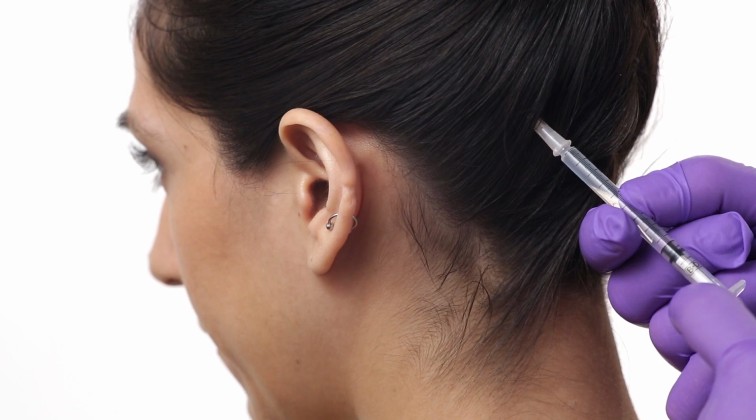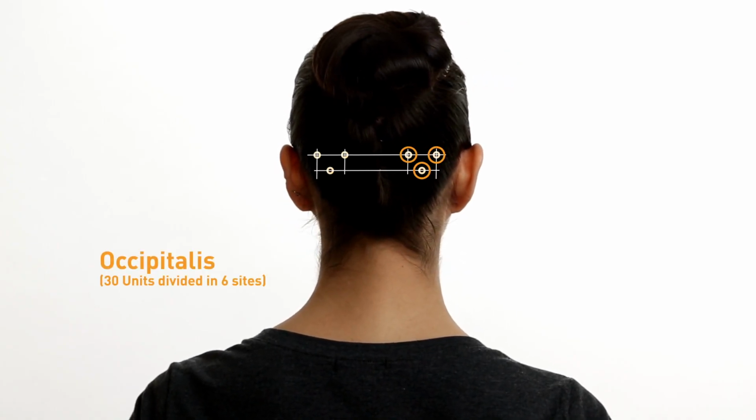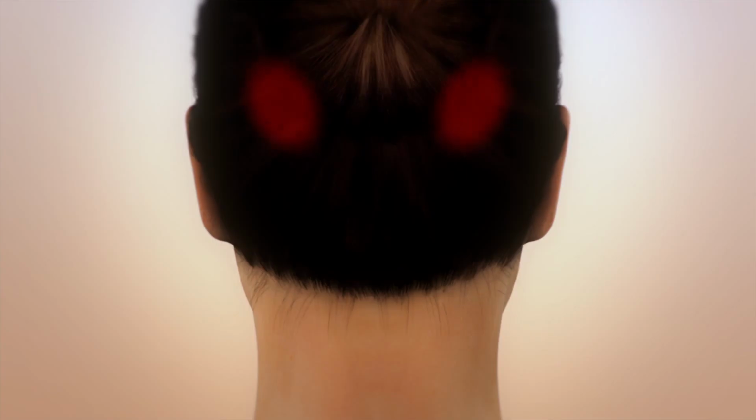Make the injection. Repeat the 3 injections symmetrically on the contralateral side. In the areas of maximal tenderness and/or pain, up to 2 additional injections may be given unilaterally or distributed bilaterally. For example, 1 injection on each side, according to the follow the pain paradigm.